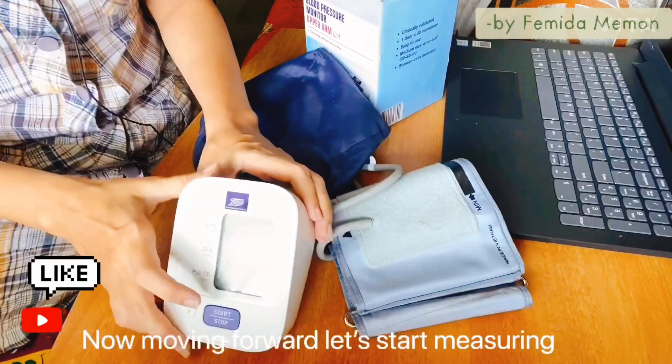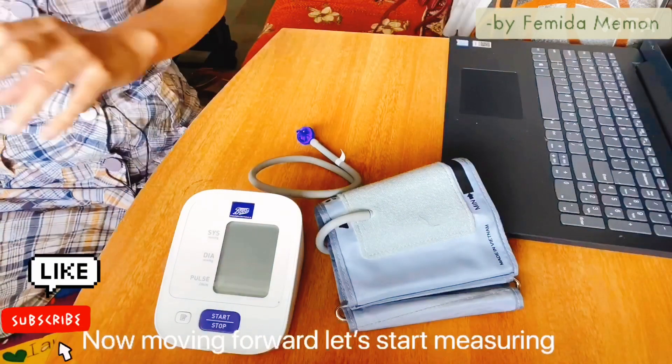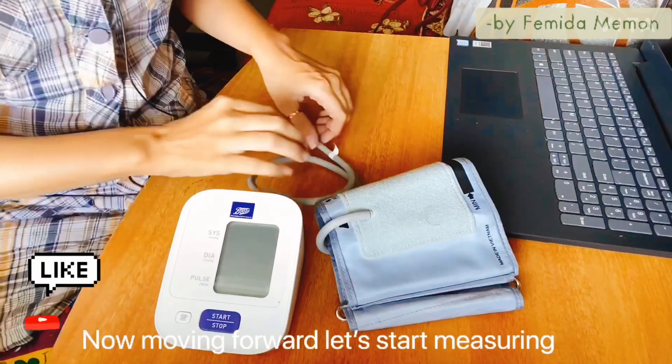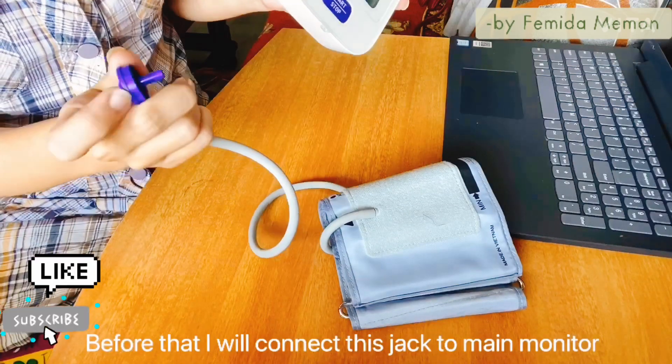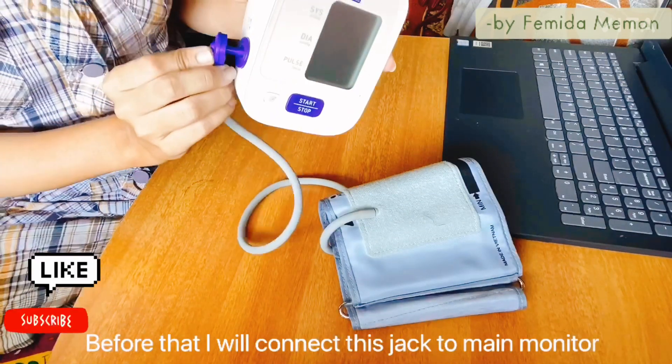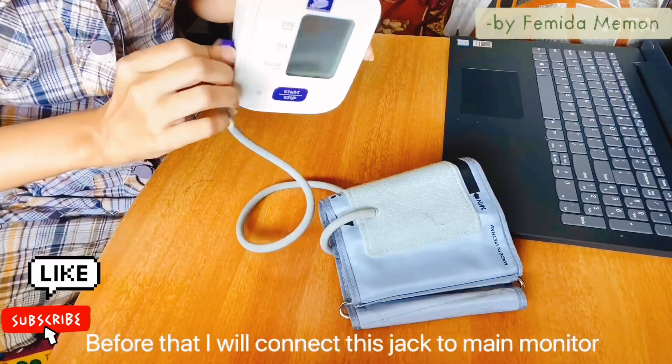Now let's start measuring. I will show you how to measure blood pressure with this machine by measuring my own blood pressure. Before that, I will connect this jack to the main monitor in this manner.